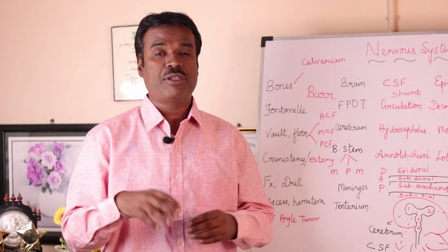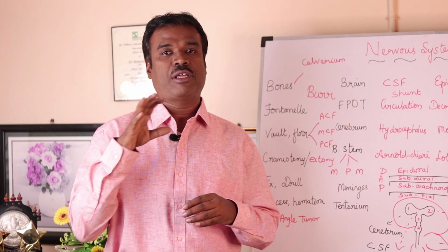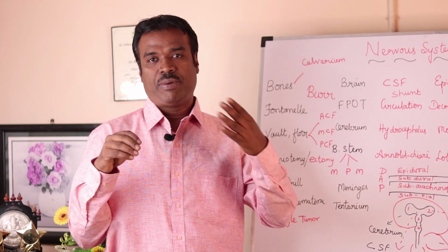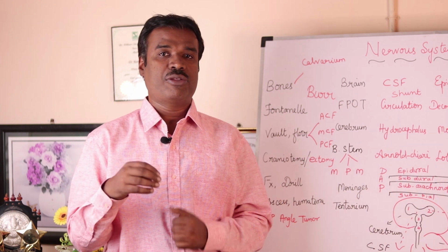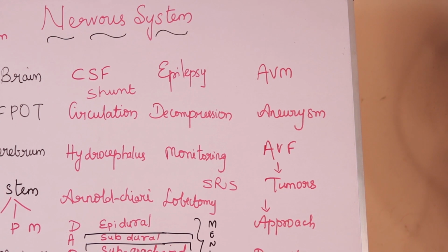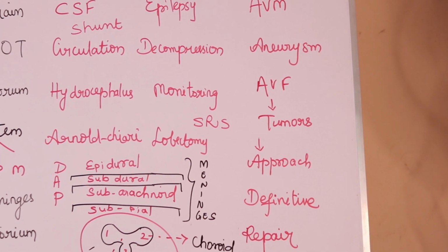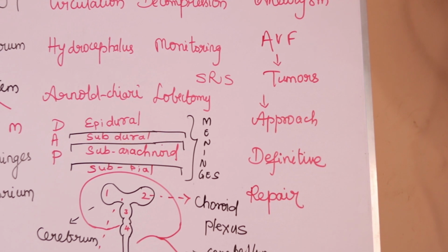What happens in a programmable shunt is that the physician places a device subcutaneously, and this allows a kind of threshold pressure. Whenever the threshold pressure is exceeded, a shunting mechanism begins to take place, where the fluid is drained into the body cavity. This reservoir is actually a subcutaneously placed pump, or a device placed within the subcutaneous scalp region, and it measures the pressure changes in the brain.